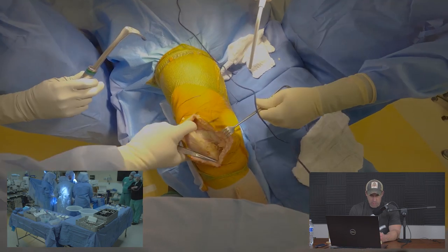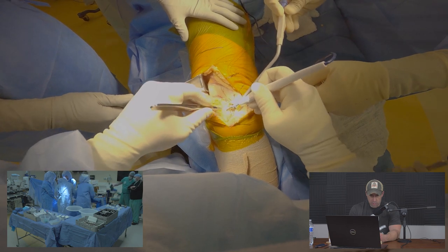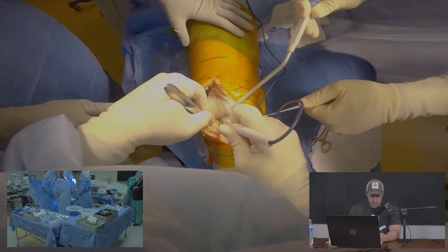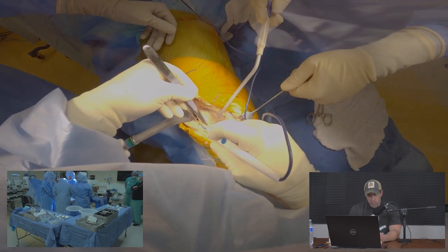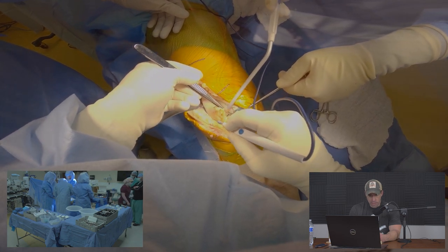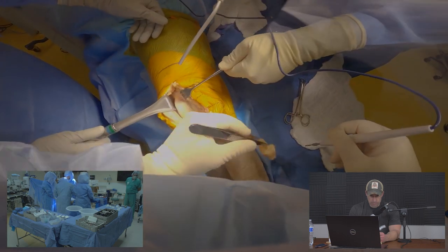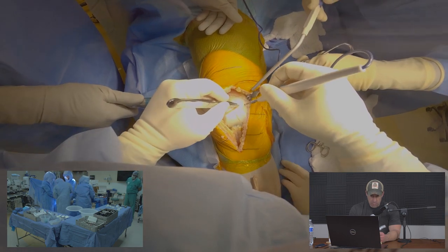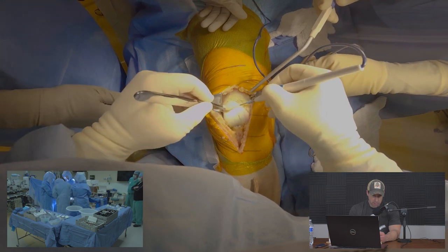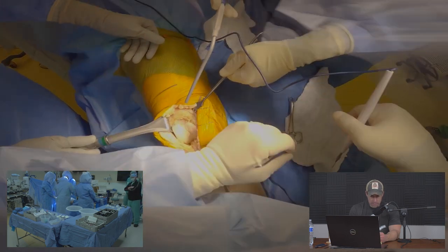We're bringing the knee to extension and releasing soft tissues along with a portion of the retropatellar fat pad. We excise a large portion of the retropatellar fat pad as it's in the way — if too much is left it can interpose in the joint and cause swelling or pain. We also take a small amount of synovium and suprapatellar fat pad to define the bone for the anatomically shaped implant.